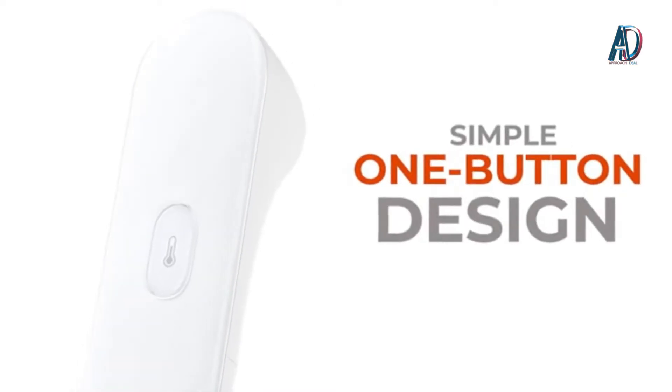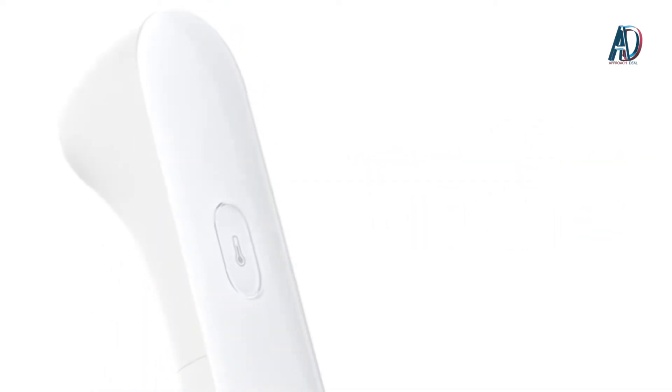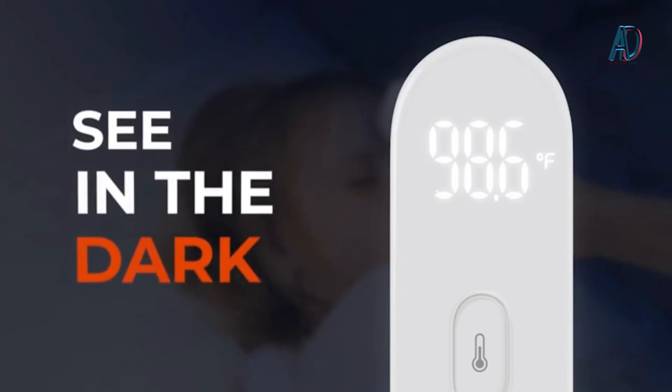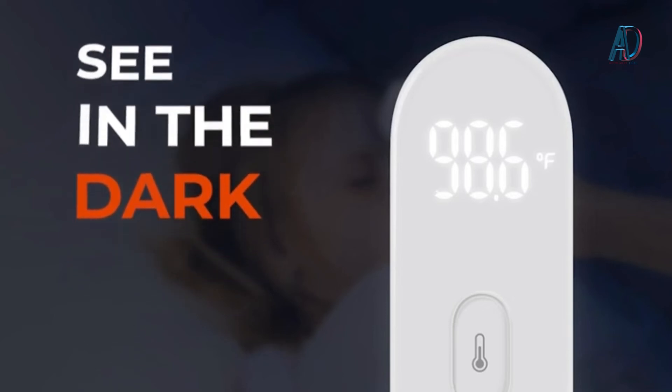A sleek, one-button design makes taking a temperature simple. Just hold the button until you feel a gentle vibration. The LED screen displays the reading in bright white light, so you can clearly see it, even in total darkness.